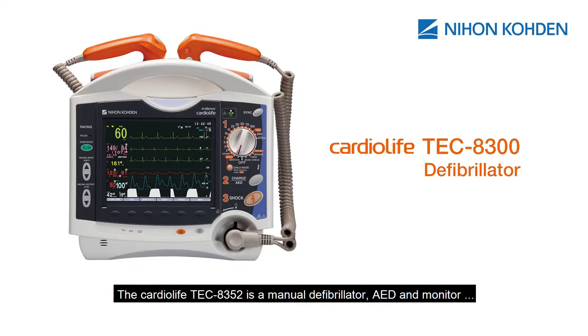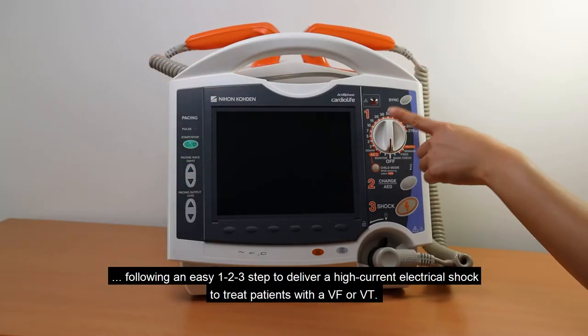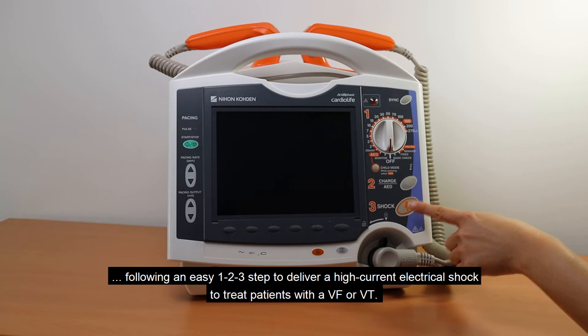The Cardiolife TEC 8352 is a manual defibrillator, AED, and monitor, following an easy 1-2-3 step to deliver a high-current electrical shock to treat patients with VF or VT.